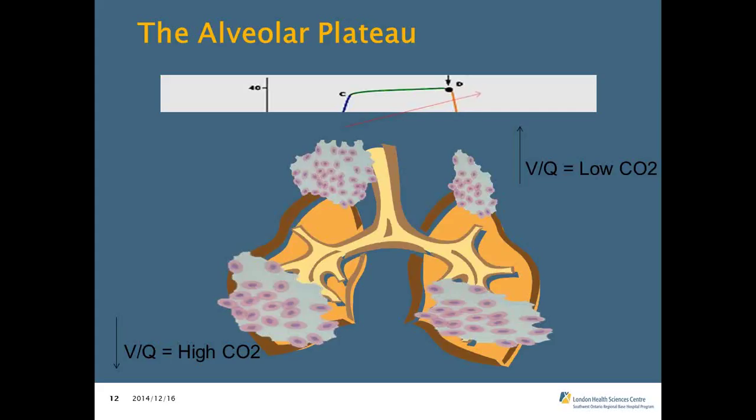So very quickly, if we were talking about a couple of conditions that may increase the carbon dioxide levels, if we were looking at someone who was suffering a narcotic overdose, as they begin to hypoventilate, they may have changes in their end-tidal CO2. We can also look at a patient who's experiencing bronchoconstriction and subsequently treated with salbutamol. We would see changes in this area of the plateau.